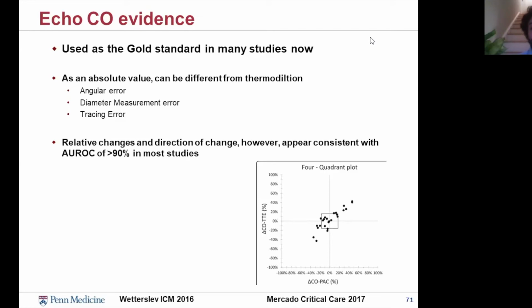For those patients, the windows that are almost always still available are the lung and the carotid and internal jugular veins. So even though the internal jugular vein is very difficult to assess for a patient who's very obese with physical exam, with ultrasound, it is still easy. Similarly, the lung is oftentimes very difficult to assess through auscultation for an obese patient, but lung ultrasound will still let you see whether there are A lines or B lines. This still is limited as compared to your thin or non-pregnant patients, but sometimes can give you just a little bit of information to help you out.